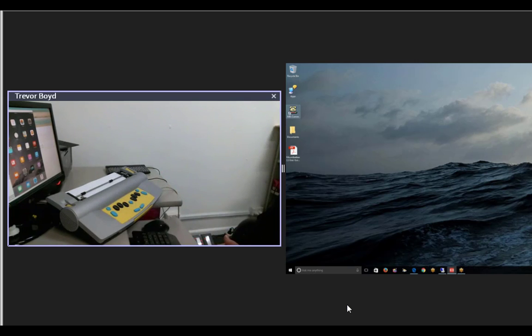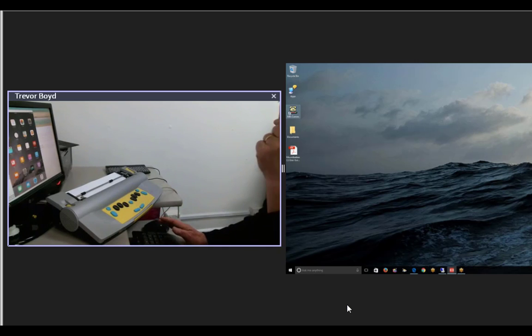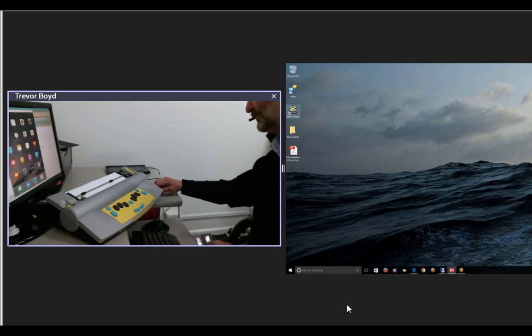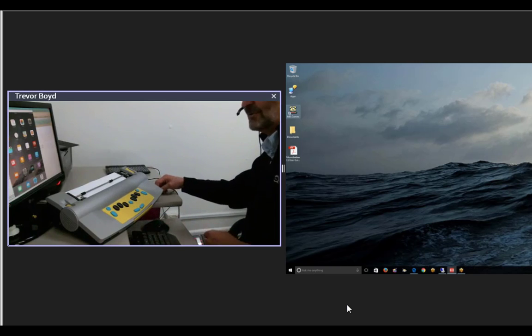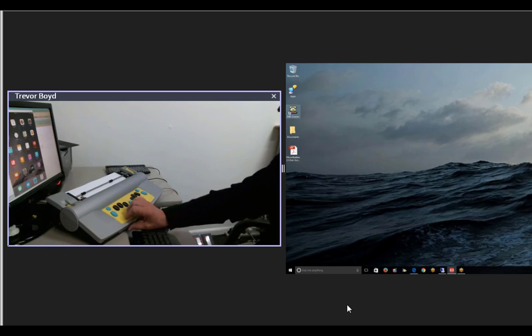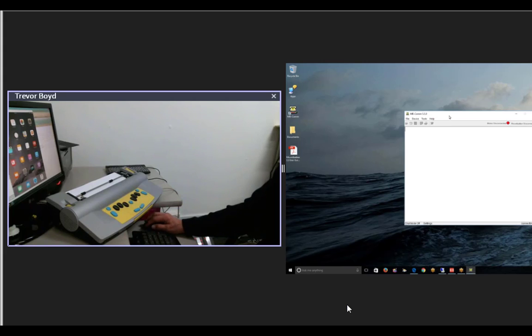So if I want to do MB Comms, I've just got this USB and I'll plug that into the Mountbatten. One of the big things is the Mountbatten was designed to be used, obviously, for people who are vision impaired, so it gives a lot of really wonderful audible hints. For example, when I plug the USB in, if I've loaded the drivers and the computer is right, it says USB connected. If it says that and you've just installed it, the drivers have gone in well.